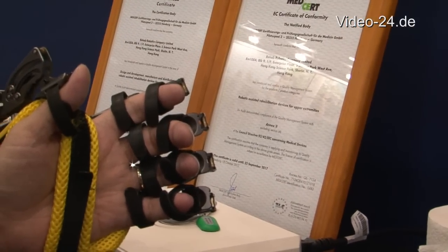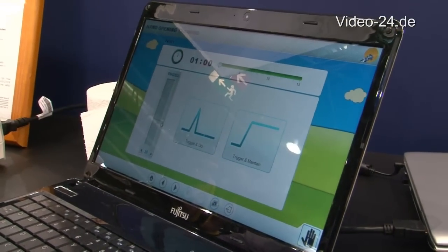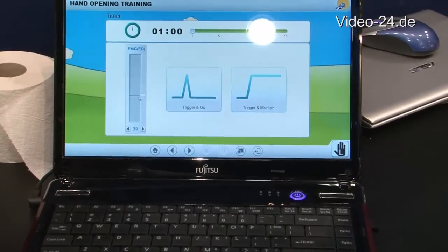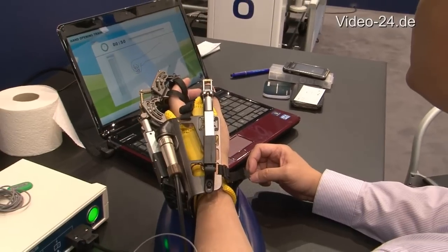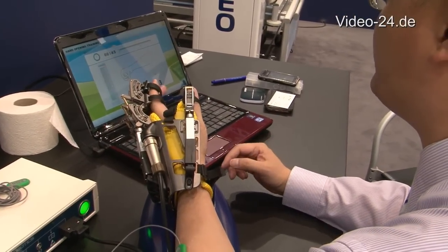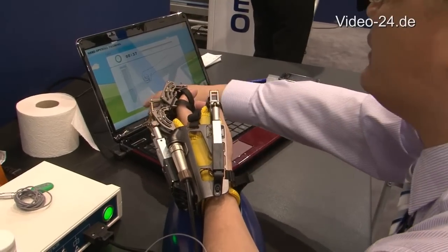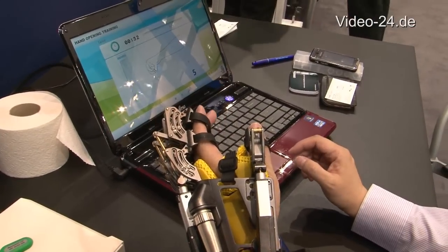Now I can set the trigger off level. This is the maximum EMG. This is the resting EMG. And now I can set a different level for the patient. Let's say I set it at 50%, and then I have to think about extension. You make the light on the display. When I think about it, it will move. If I don't have intention, it will not move.